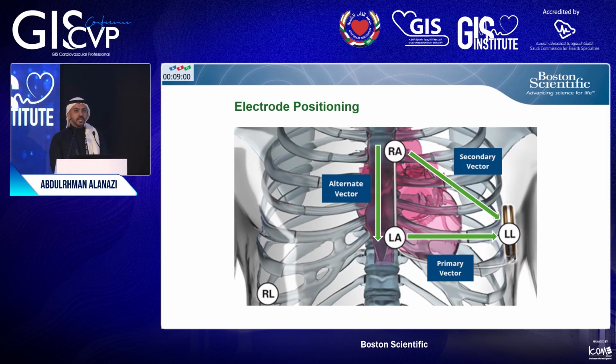When we are doing it, we have to palpate the xiphoid process at the bottom of the sternum. Then we go 1 centimeter superiorly to the left, and we put our left arm lead there. Then we go 14 centimeters above it.